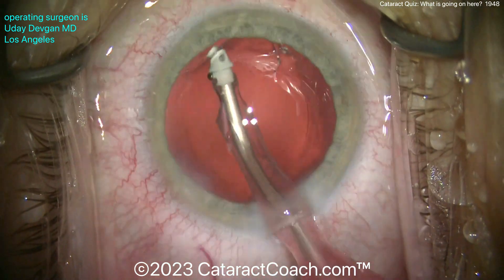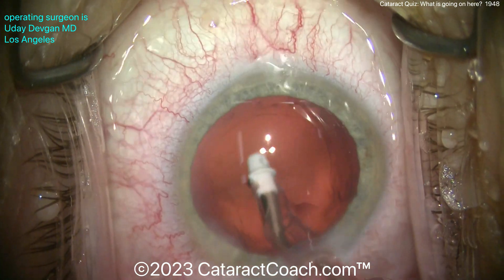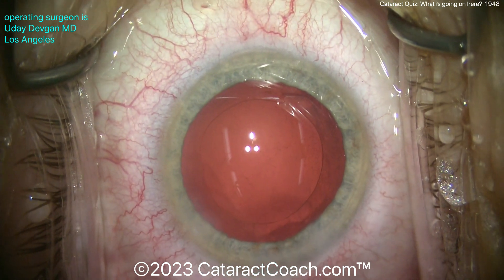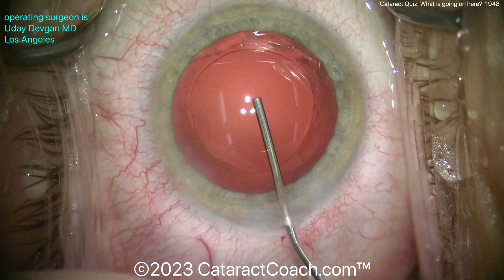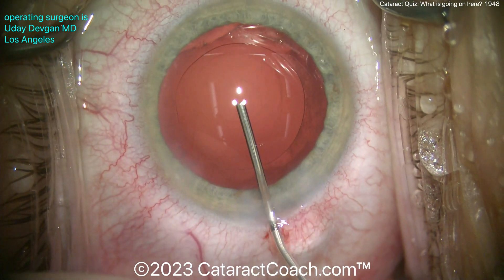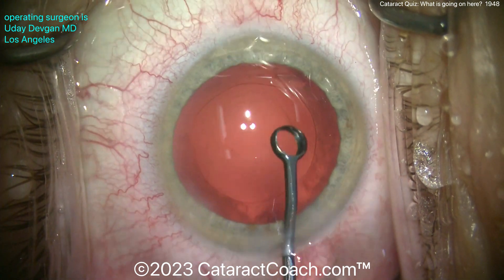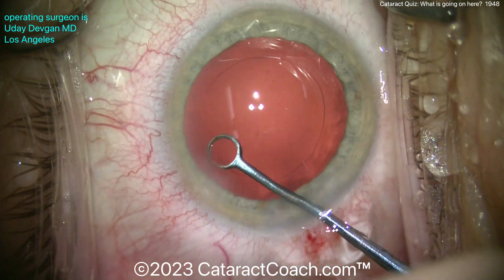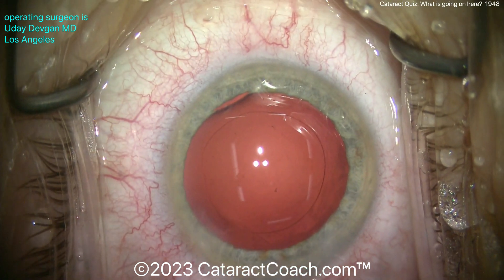A little advantage of having those cells there — now we can go back and clean them up. What's that other strange line down the cornea? Is that something in the eye? You saw that line — it was kind of coming and going. Watch carefully again. Filling up the eye with our cohesive viscoelastic — that line, what's that there at the top of your screen? I think it's a mucus strand on the cornea. Let's go in here with the polisher and polish up the anterior capsule rim. It looks pretty stable — yeah, that looks like a mucus strand on the surface of the cornea.